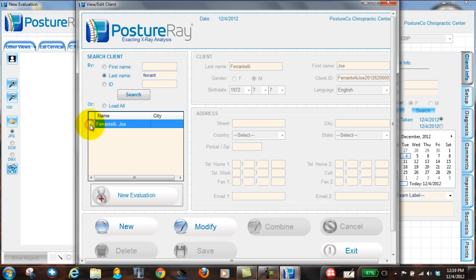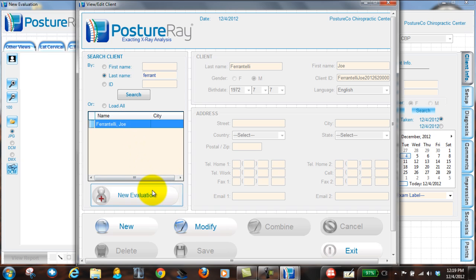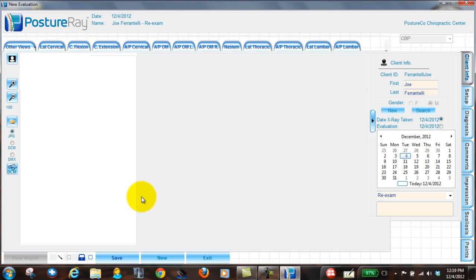There I am. And it's very important that if they misspell the name on the digital X-ray CD or in your digital X-ray system, PostureRay is going to have a hard time finding it. So you got to pay attention there, have your staff pay attention when they shoot those X-rays. We hit new evaluation.